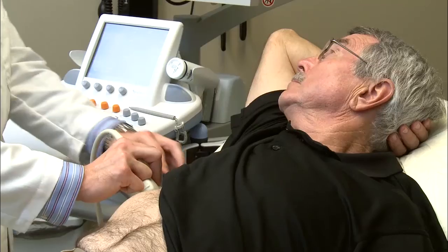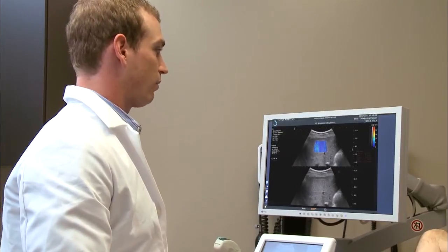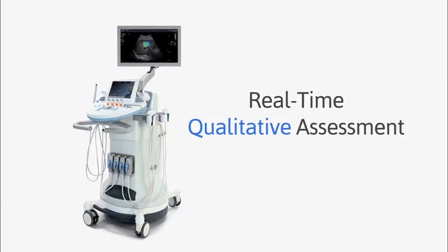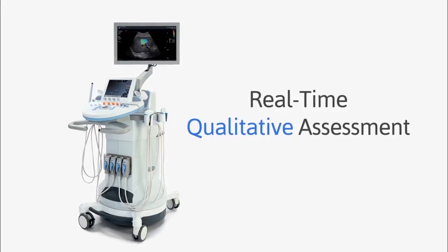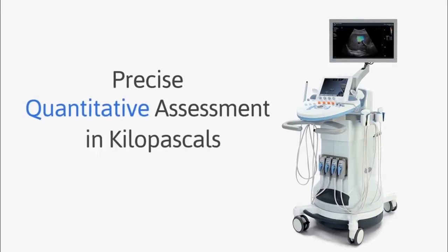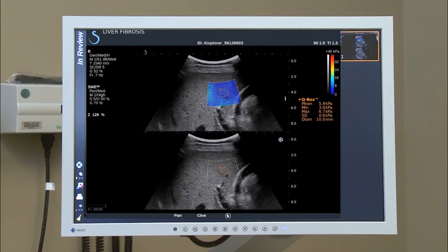And so it's a very effective way to non-invasively follow patients over time to assess chronic liver injury. Shear-wave elastography provides qualitative information instantaneously. So the color code for shear-wave elastography is blue, shows a liver that has little fibrosis. Red is a liver with extensive fibrosis, and there's gradations in between. So you can instantaneously get a qualitative measurement while the patient is there within around 30 to 60 seconds. And then quantitative assessment takes slightly longer, and it gives you more precise measurement of that qualitative assessment.